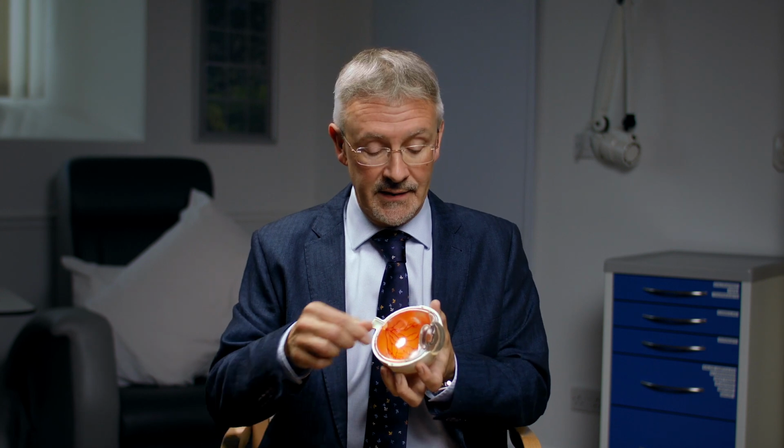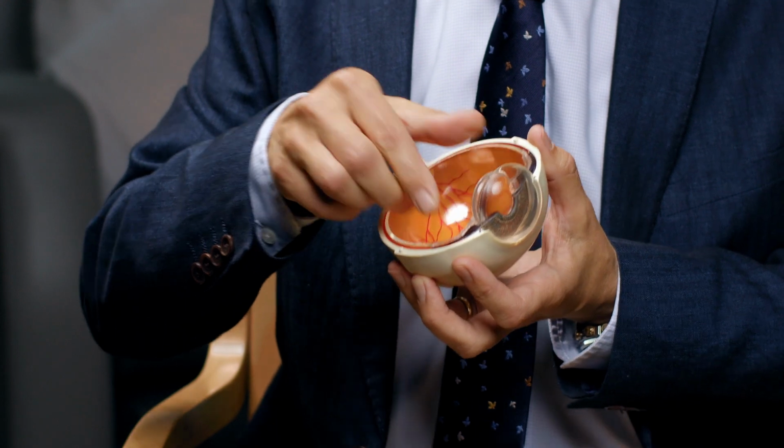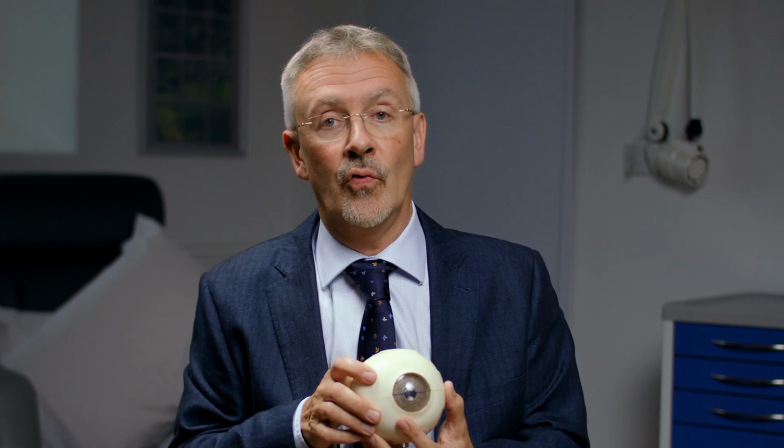After removing the cataract, we place the new artificial lens in exactly the same location where your natural lens used to be. This will remain in your eye permanently, helping to focus light properly onto your retina. This tiny incision is usually self-sealing and doesn't require stitches. It will heal on its own.